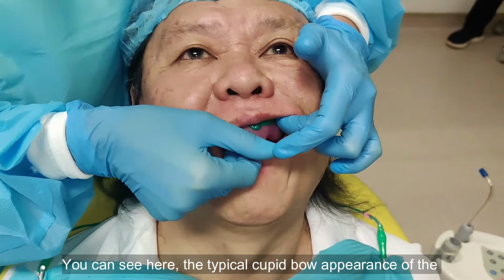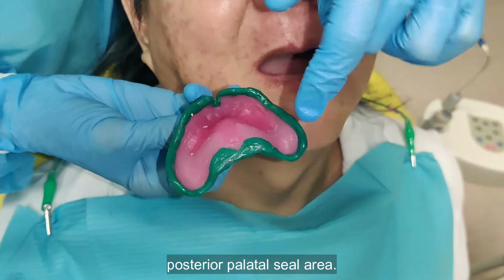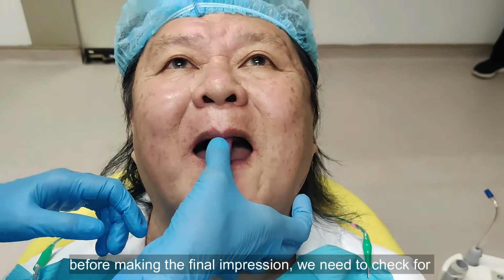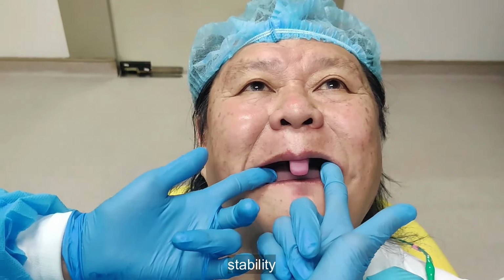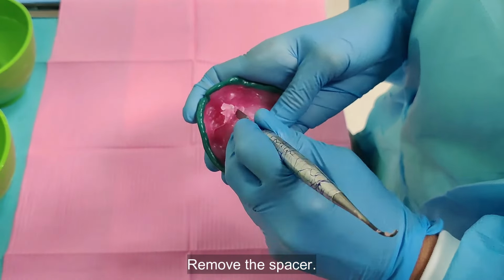You can see here the typical cupid bow appearance of the posterior palatal seal area. Once the border molding is completed, before making the final impression we need to check for retention, stability and support. Remove the spacer.